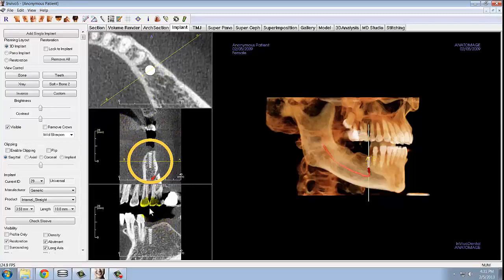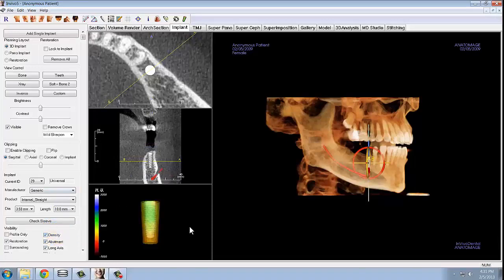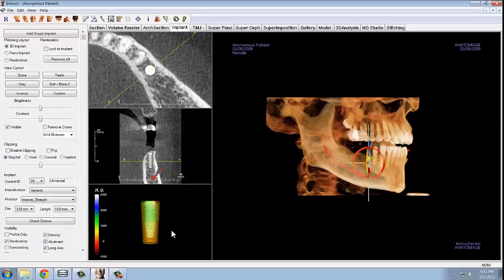This third section of the rendering window uses a color gradient to show the density of the bone surrounding the implant. This gives a quick and easy indication of whether or not the implant is placed in bone or not. However, often times it is most useful to actually turn off density visibility in order to see an additional cross section.